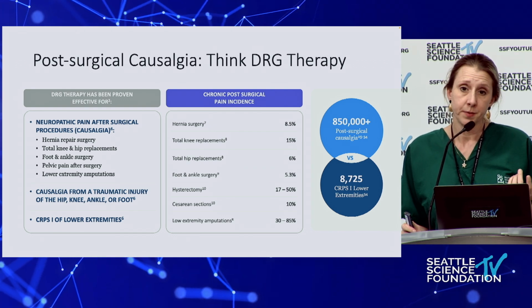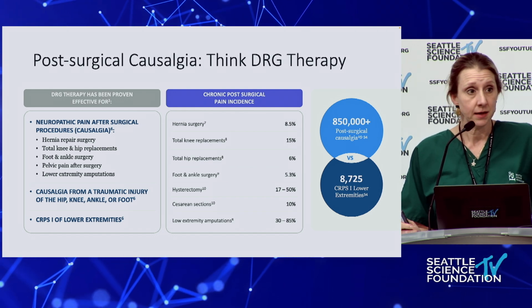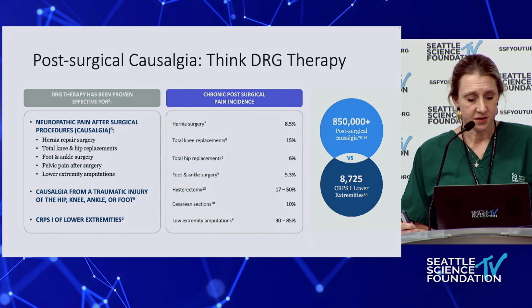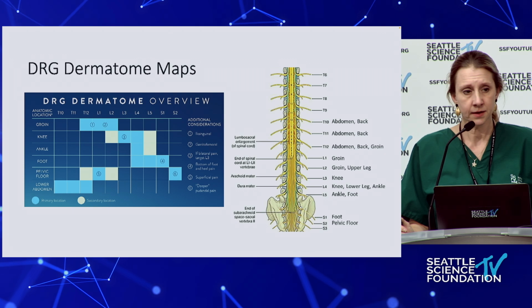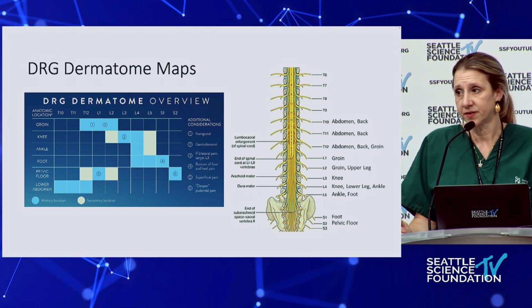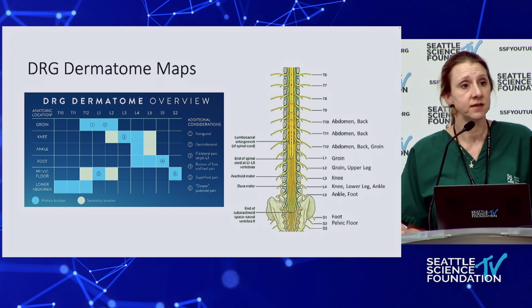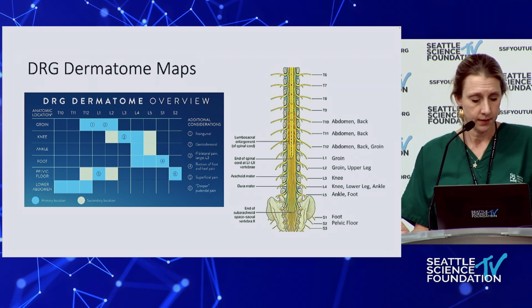This can be very, very helpful for patients that have neuropathic pain following a total joint replacement, as a last resort in many cases for those patients. And there are other post-surgical conditions that have persistent neuropathic pain afterward. This is also really helpful for a patient that has exclusively foot pain. With conventional spinal cord stimulation, historically, we've considered it a bit of a challenge to really isolate the foot. And with dorsal root ganglion, you can do that by looking specifically at L5 and S1 for the stimulation territory.